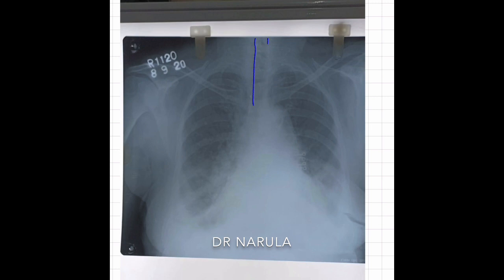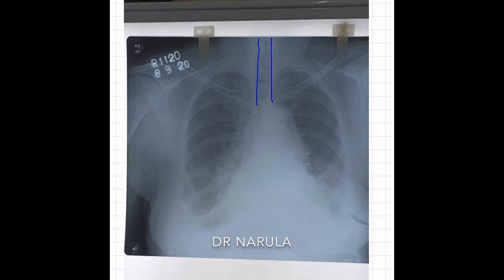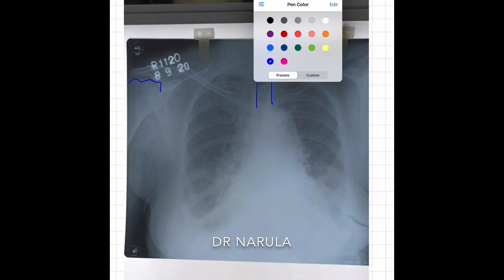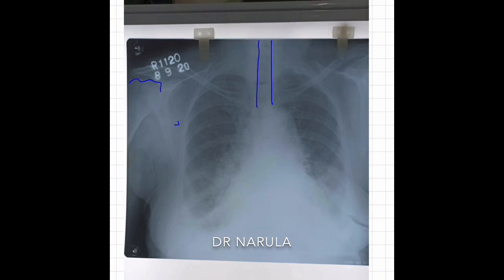We will first see the trachea, and we can see the trachea is central. Now we will see the bones — the humerus of both sides are normal, the joint is normal, there is no fracture in the ribs, there is nothing. We then see the soft tissues of both sides — there is nothing abnormal.